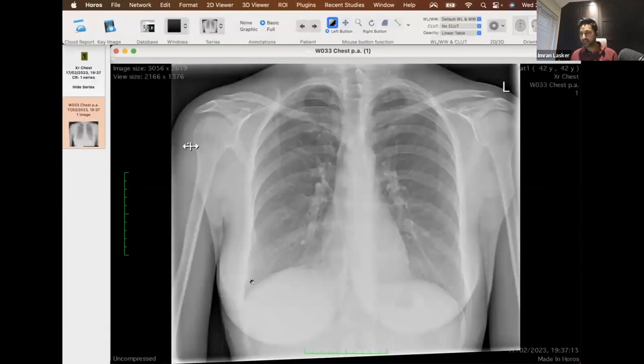Now, this one I think can be a bit of a challenge for people. Do throw in what you think it is, and in the meantime, I'll talk my way through it as well, so that we can sort of work through it. Because I want anyone who comes to this to be able to work through the problem rather than me just giving you the answers, because I don't think giving the answers is the way forward when it comes to teaching.